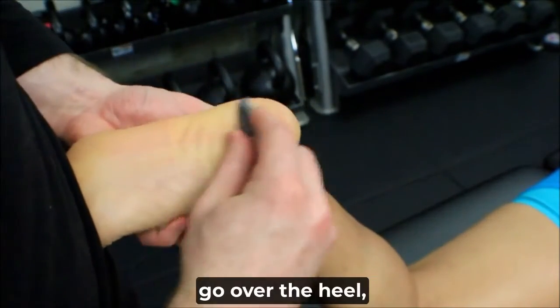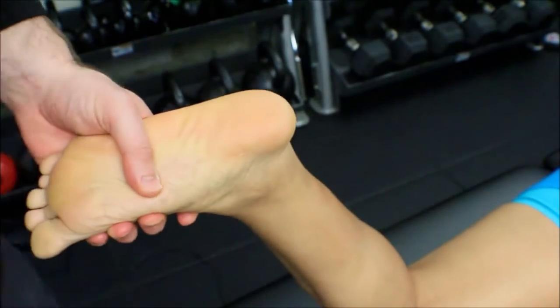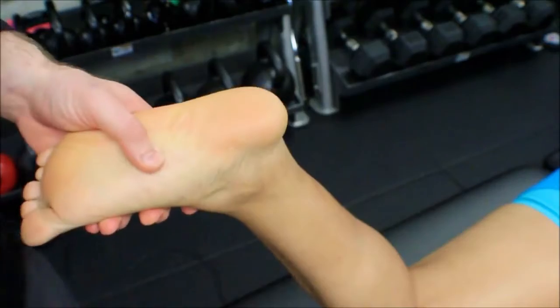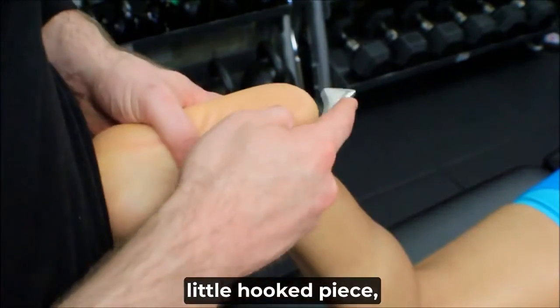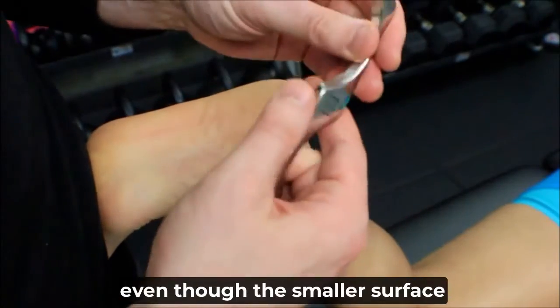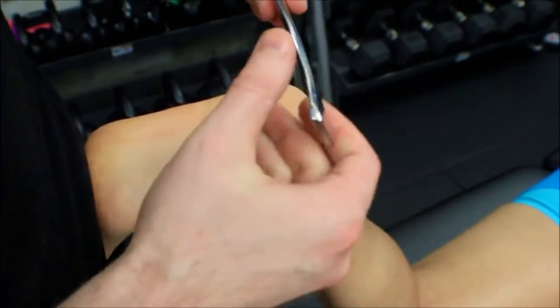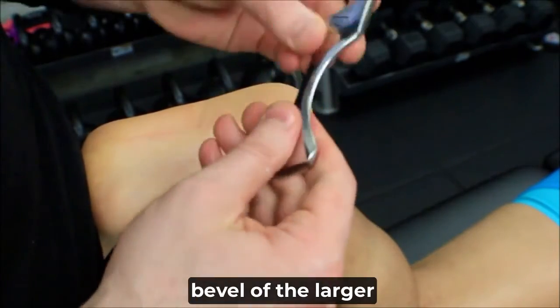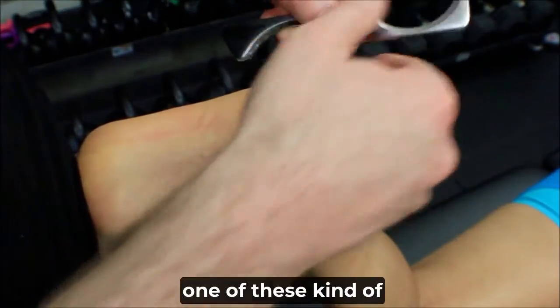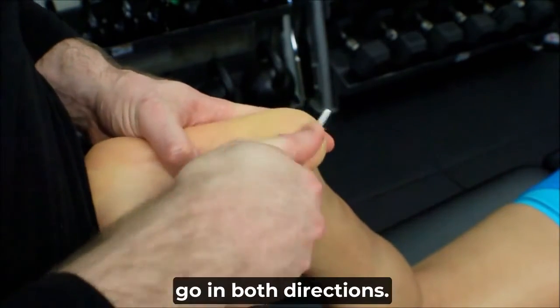Right? And then if I want to go over the heel, we're going to use this little hooked piece. I'm going to use actually the smaller surface, even though the smaller surface happens to be a single bevel. I'm just going to watch how hard I press, as opposed to the double bevel of the larger one of these. Right? Come through here, go in both directions.